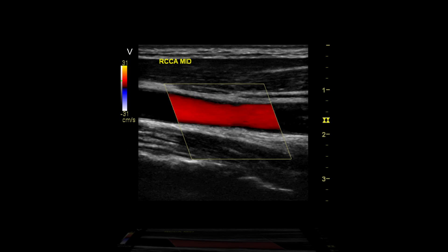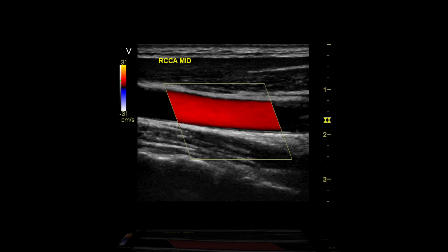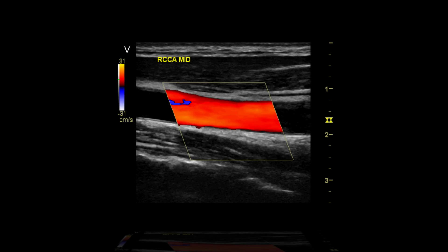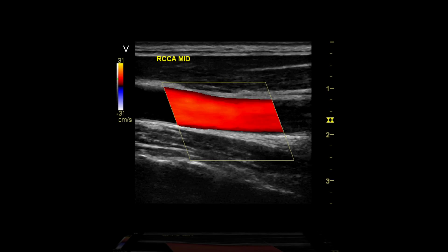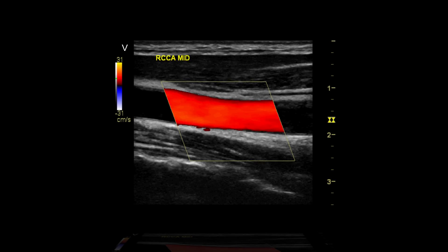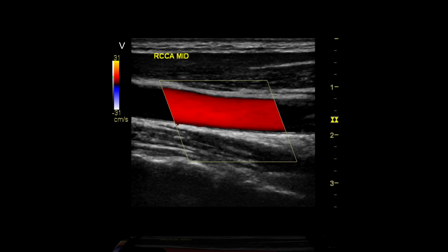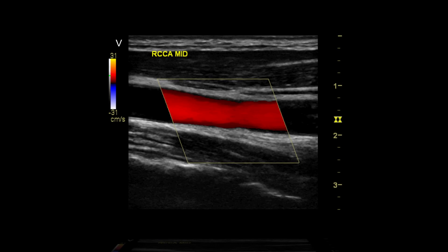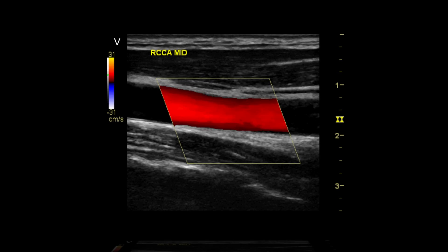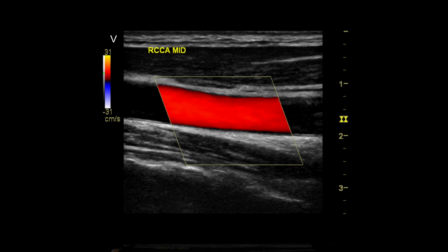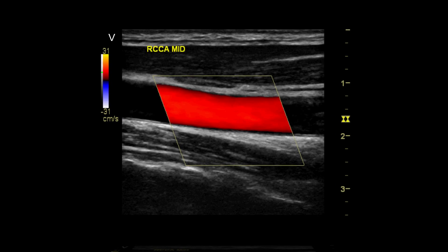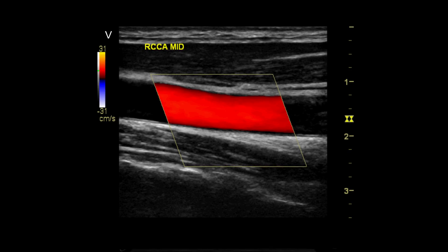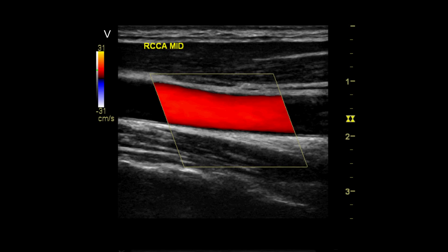By convention, the display should be configured so that flow within arteries is represented as red, and flow within veins is blue. The color bar can be inverted. This is generally done to display normal directional flow in an artery to be represented with red color.